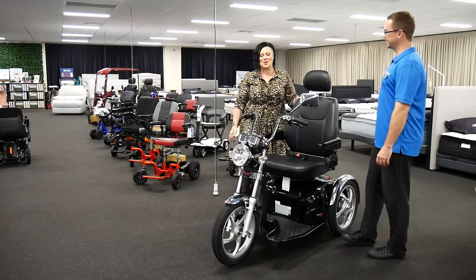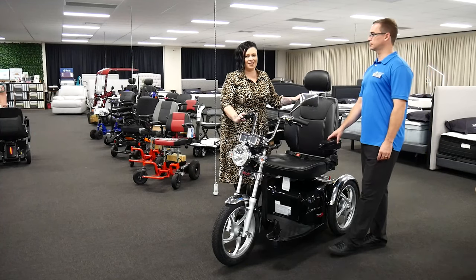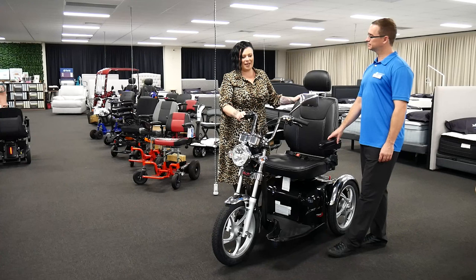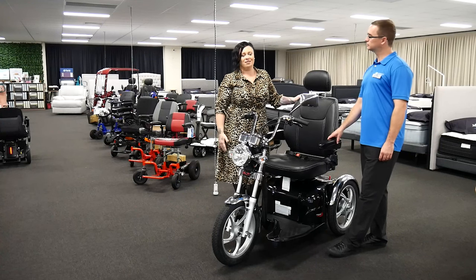The Sports Rider by Pride Mobility. The Sports Rider is for those that are just not ready to take on a mobility scooter in terms of the look of a mobility scooter. It keeps the young ones alive and those looking to have that independence that aren't necessarily in need of an old people's scooter.